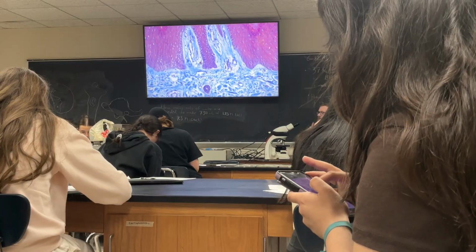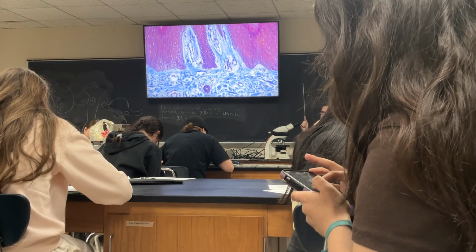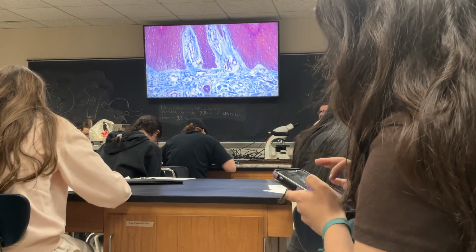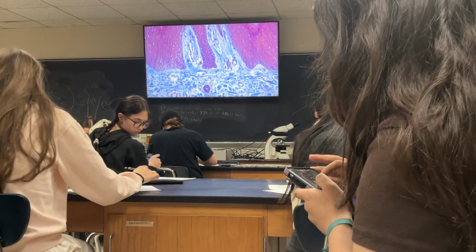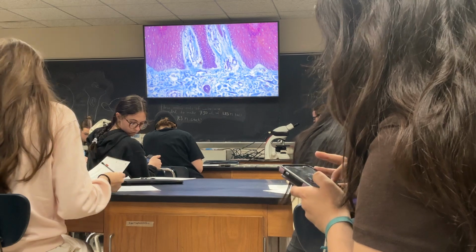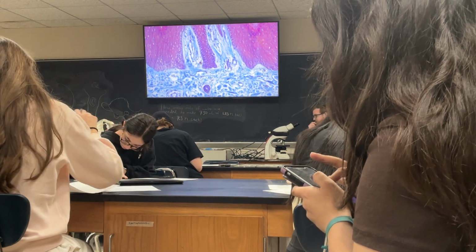Okay? So areolar connective tissue, a good place to find it is just deep to the epidermis of the skin. And then deep to that, the reticular layer of the dermis is going to be dense irregular, which is 6.1 on the bottom of page 12. Okay, you need to add that in. 6.1 dense irregular on the bottom of page 12.